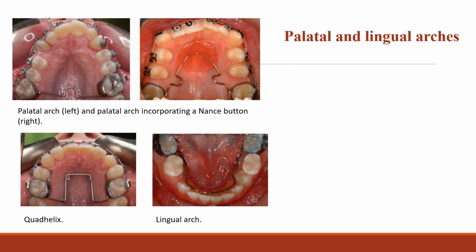Palatal and lingual arches consist of a rigid stainless steel wire soldered onto molar bands, like here in the picture. The orthodontist fits the relevant molar bands in the mouth, but does not cement them in place.